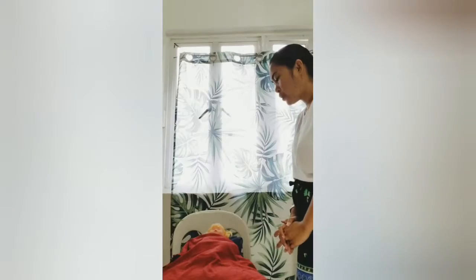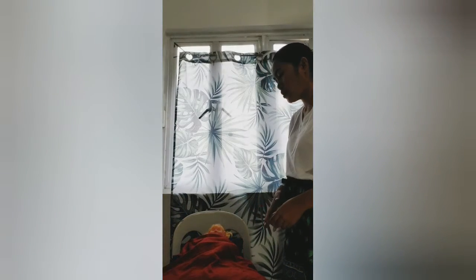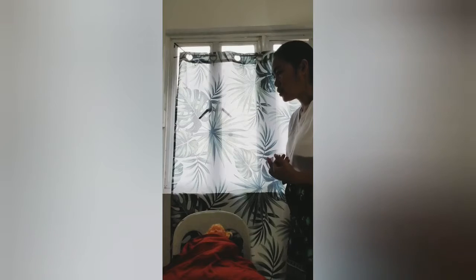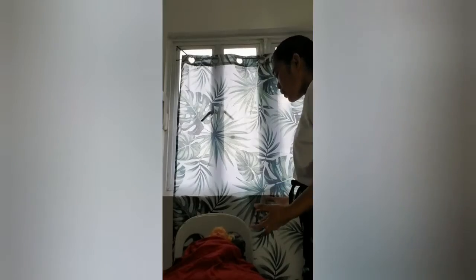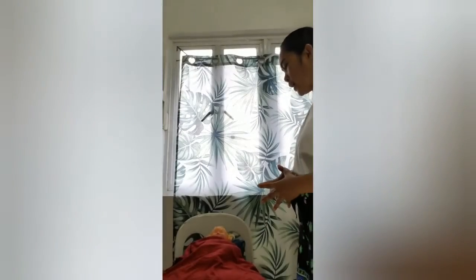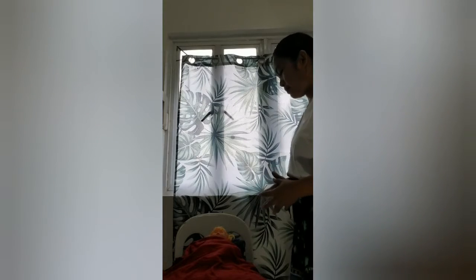Okay. Your doctor has ordered an enema solution for you today. In this procedure, we are going to put the solution inside your rectal area to alleviate the constipation that you're feeling. So Mom, this procedure is safe, and breathing through your mouth could really help.